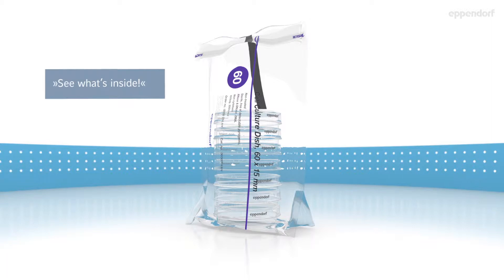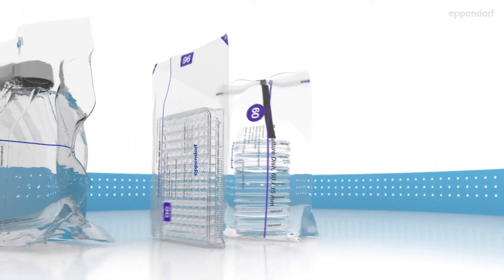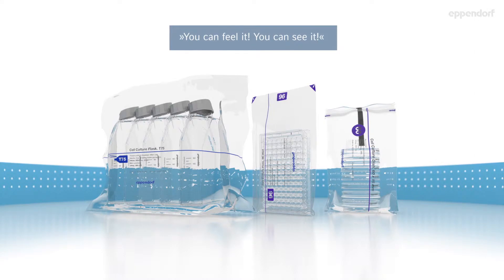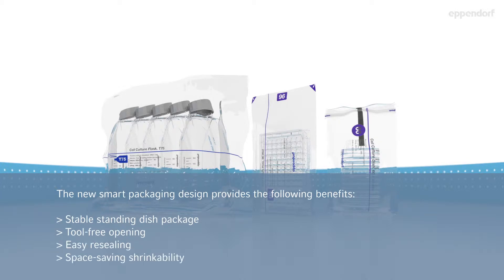See what's inside — easy and distinct product identification: product, format, surface and purity. All products can be easily distinguished by a clear icon and colour system. You can feel it, you can see it. The new smart packaging design provides the following benefits: stable standing dish package, tool free opening, easy resealing, and space saving shrinkability.